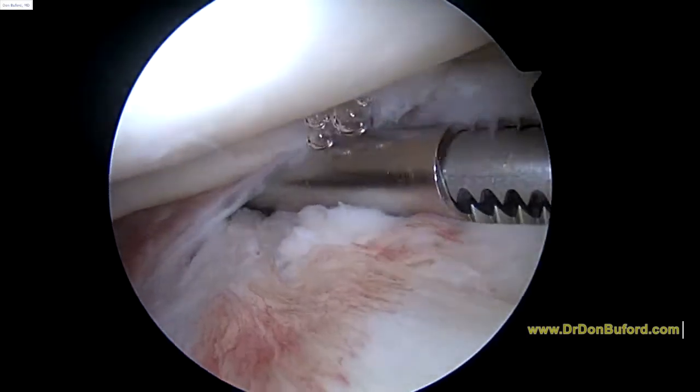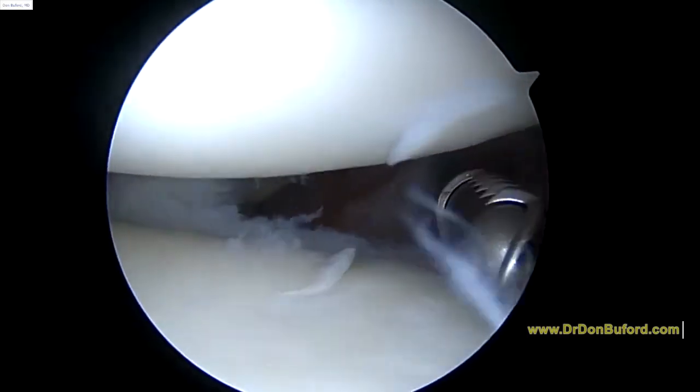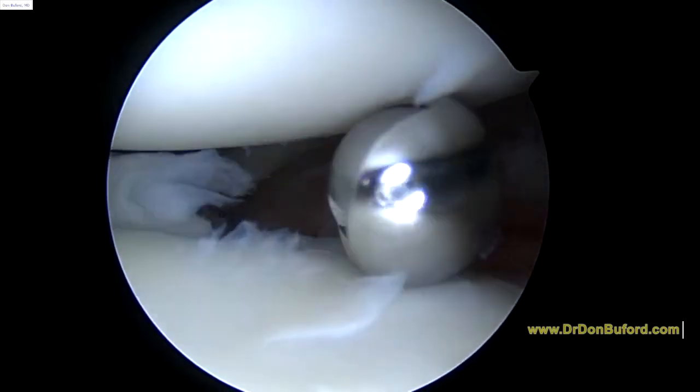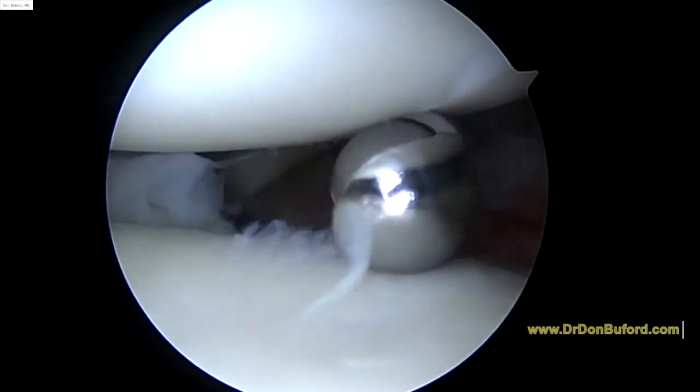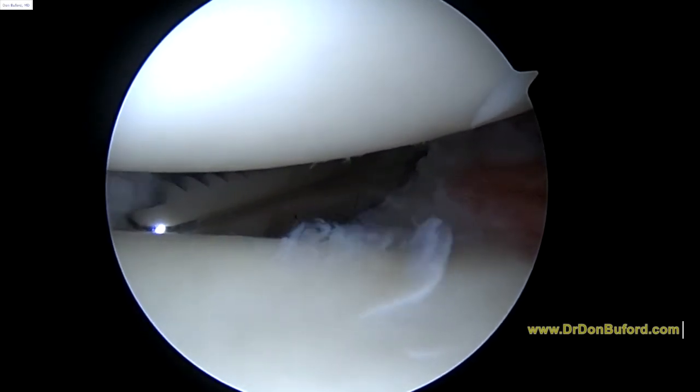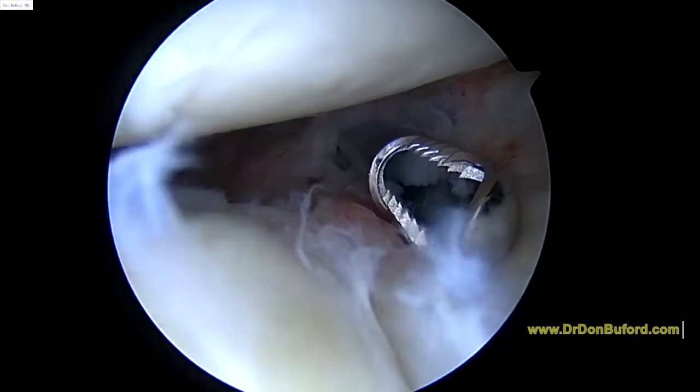So we've cleared up inside the joint. I'm not really seeing any significant biceps tendon left inside the joint to worry about, so that's a good thing — it's a little bit less surgery you need at this point. Pull the shaver, please.